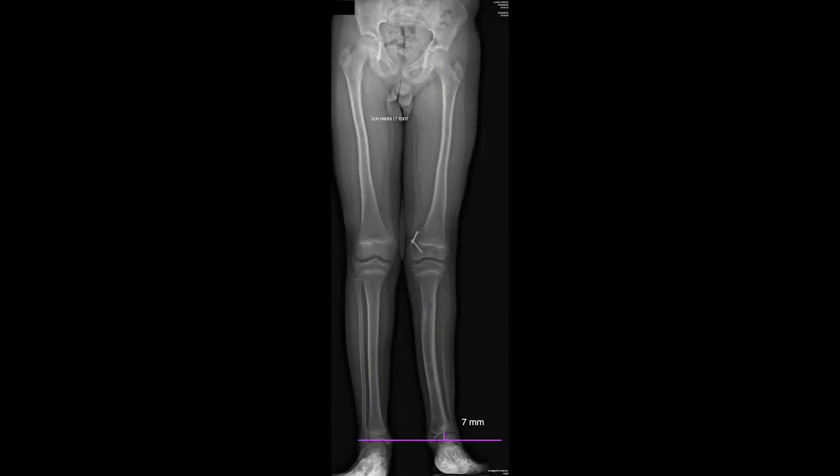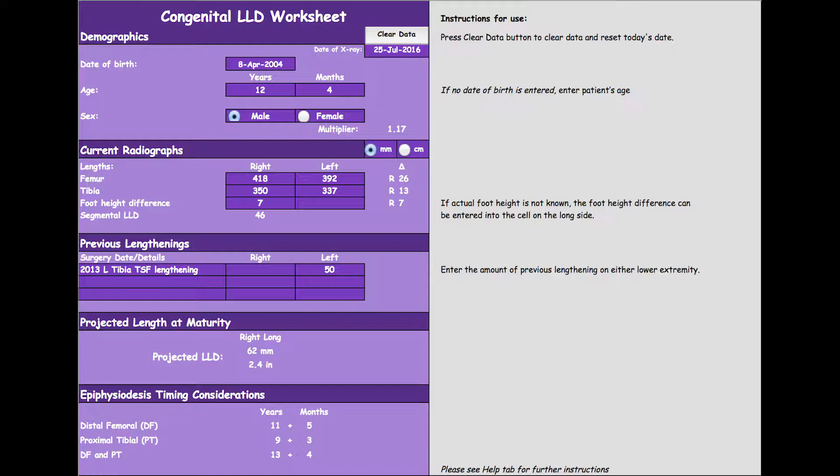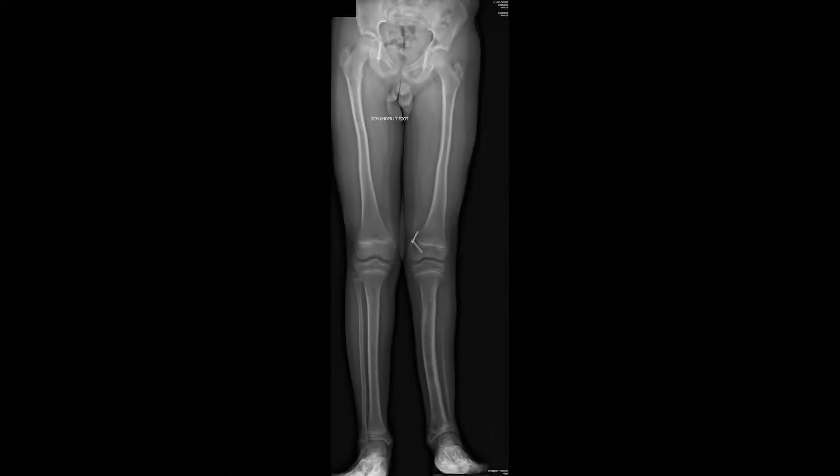Foot height difference is then assessed as it can be a significant contributor to congenital leg length discrepancies. For skeletally immature patients, these segmental lengths are then recorded in our spreadsheet to calculate predicted limb length discrepancies. In order to confirm the validity of these measurements, it's important to look for joint contractures, which would affect the segmental differences as measured on the AP x-ray. Our patient had a previous 50 mm lengthening of his left tibia, which is also recorded in the spreadsheet, as this affects the predicted limb length discrepancy.